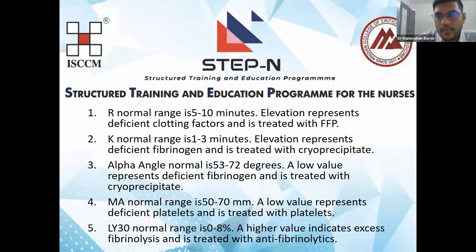Alpha angle normal value is 53 to 72 degrees. A low value represents a deficiency of fibrinogen, and it is treated with cryoprecipitate. So K prolongation and low alpha angle will be treated with cryo. R prolongation will be treated with FFP. Maximum amplitude normal range is 50 to 70 millimeters. A low value represents deficient platelets and it is treated with platelet transfusion.